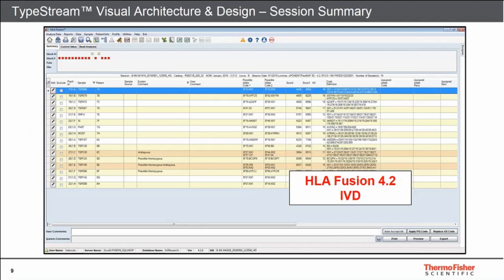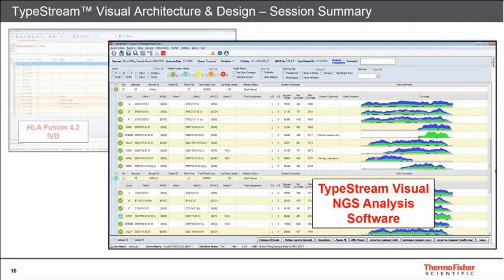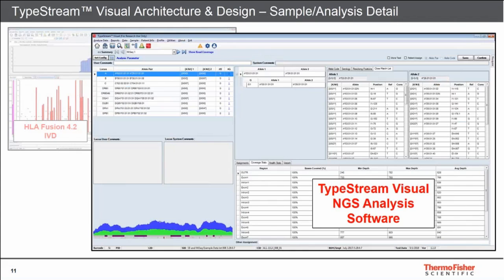Just to illustrate this point further — here's a screenshot of the session summary screen from HLA Fusion 4.2 IVD, and here's our session summary screen from TypeStream Visual. Not only does the software look the same on the home screen, but many other interfaces — session summary and sample detail — also flow through into TypeStream Visual. For laboratories currently using HLA Fusion, TypeStream Visual has a very similar look and feel, making it very easy to implement.